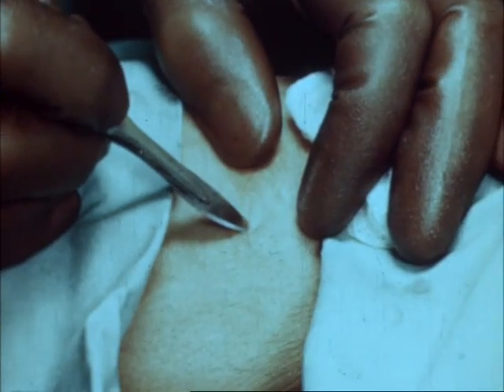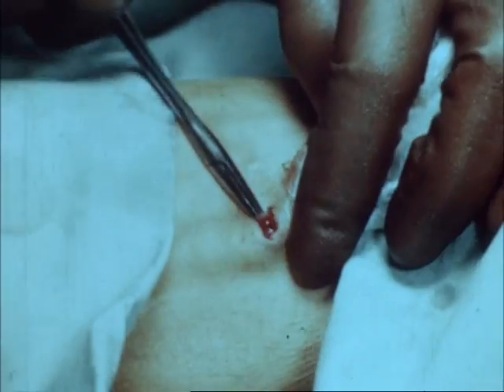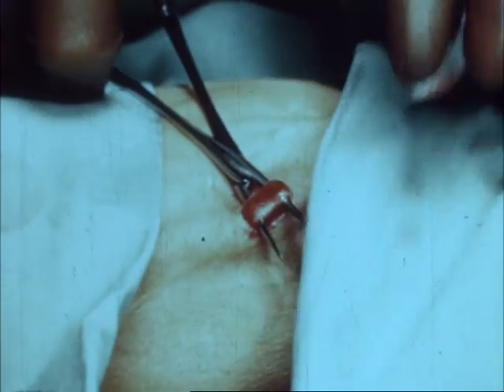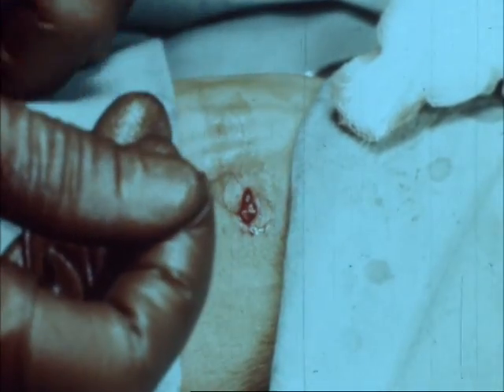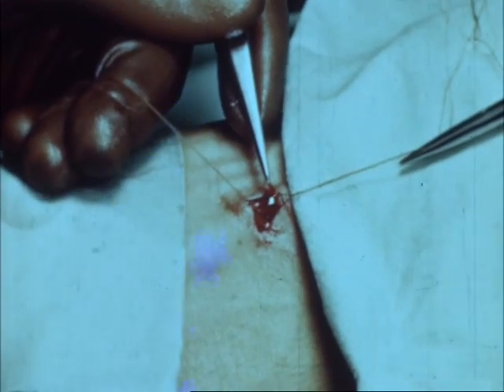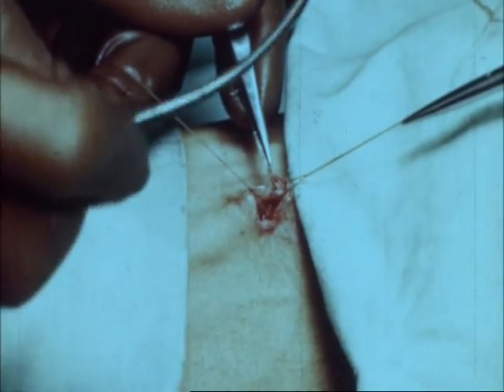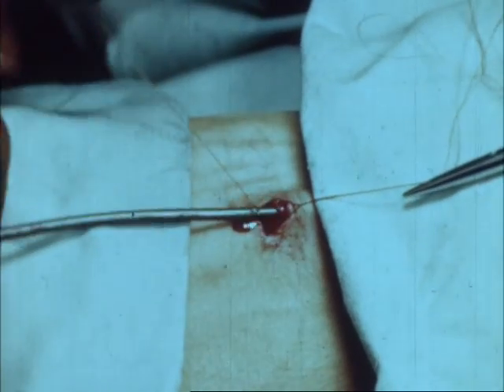When the skin has been made insensitive, a small transverse cut is made over the vein, the incision being opened up with forceps. The vein is picked up and 2 ligatures are passed round it. The lower ligature is tied firmly, while the upper is simply a loop by which about ½ an inch of vein is supported, while an opening is made into it with scissors. The catheter, with saline dripping from its tip, is then inserted with its concave curve facing medially.